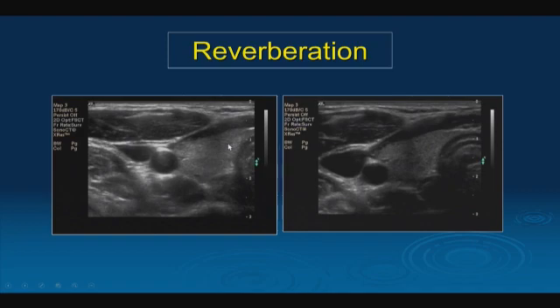This, again, is that familiar image of the thyroid, carotid, jugular, and sternocleidomastoid muscle. Notice that we have echoes here in the near field of both the internal jugular and the carotid artery. That's a ring down artifact. But it's surrounded by solid structures, so I can change my scan plane just ever so slightly to position these structures a little bit differently, where the ring down artifact then falls into the solid structures. You might end up moving it back over, but at least you've now recognized that it is an artifact and it's not something within the vessel.